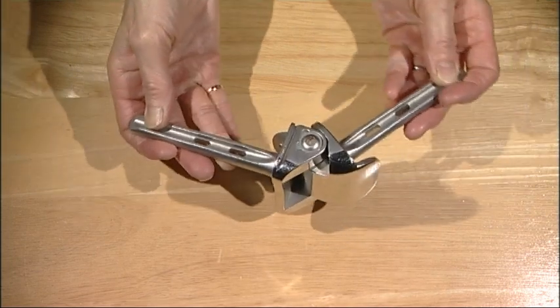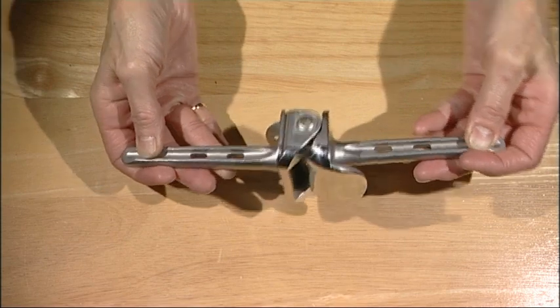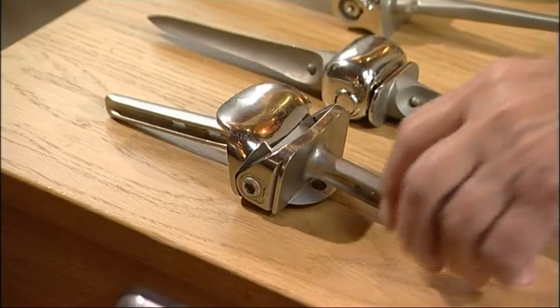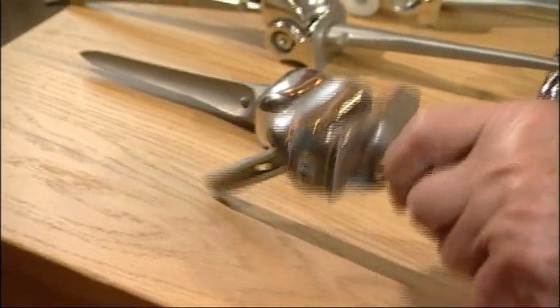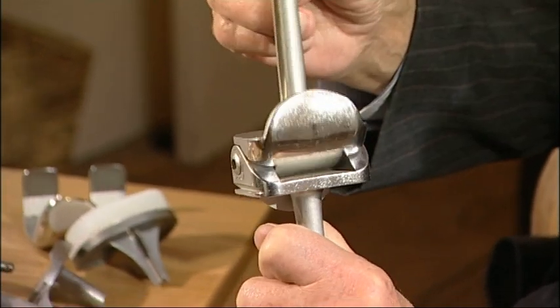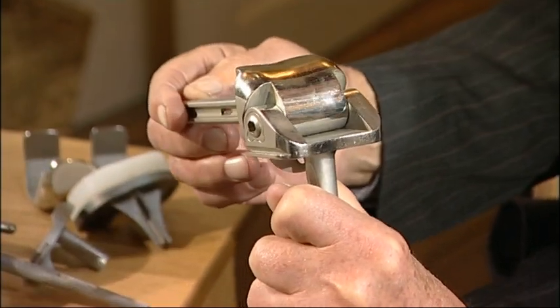It's the most radical way of trying to produce a mobile rather than a fixed joint. It was brought to my attention in 1950 or so, when I was shown and introduced to the Waldius implant. It was made in Sweden, or devised in Sweden. The insertion was simple.